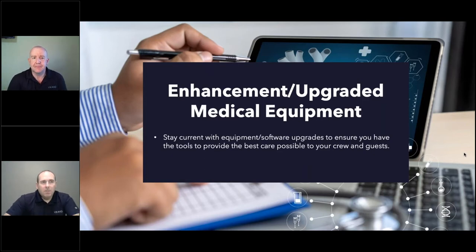Yeah, so I think sometimes we forget about these little details. So just as little reminders, when you're pulling equipment that may have been disconnected from shipboard power for a while for one reason or another, you want to always verify that the batteries in that equipment are fully charged. We all know batteries don't last forever, so maybe it's a great idea to just start replacing batteries. The other thing that we look at is there have been software upgrades by certain manufacturers. Some of these are every 6 months. Some have just come up because they created new software features for a device due to the COVID outbreak. So we want to help you with your software updates, any battery replacement accessories that you may need, those sorts of things to be mindful of.